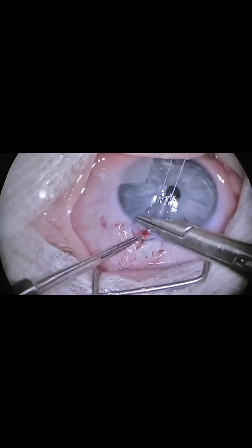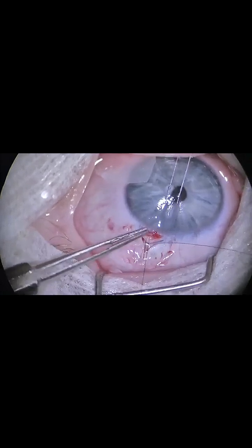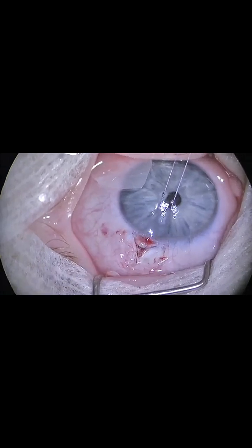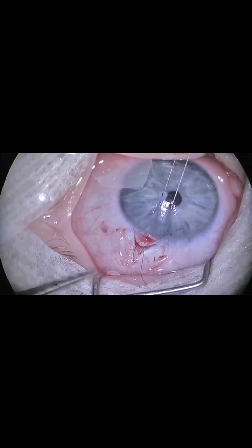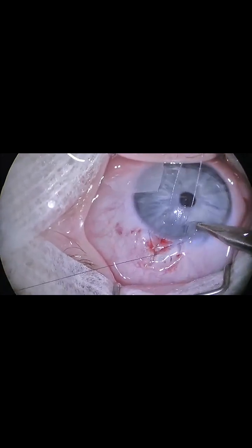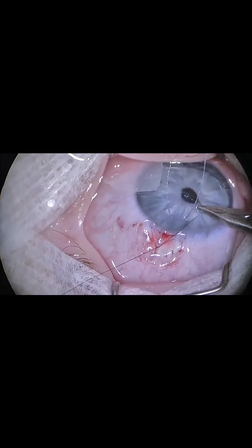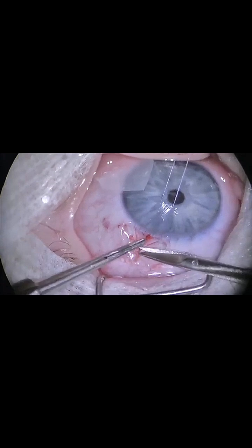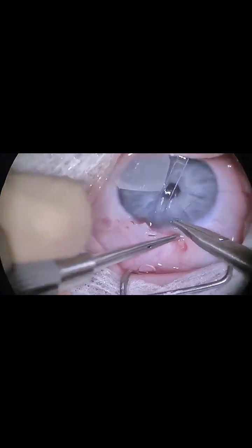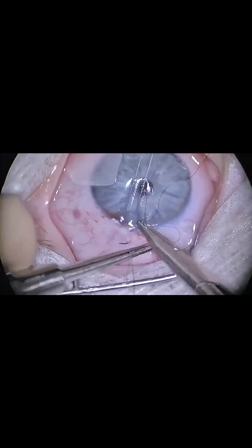A 10-0 nylon suture is then placed through the apex of the triangular flap and adjusted for a tight and watertight closure. The conjunctiva is then advanced to the limbus and closed with 10-0 nylon sutures in an interrupted and running fashion.